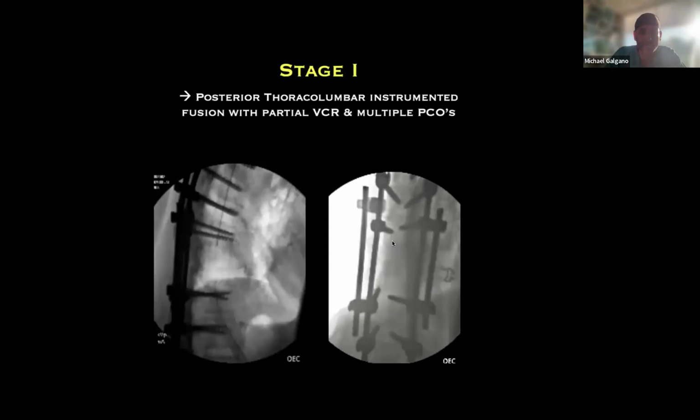So this was a case I did very early on in my career, and we decided to do this all posterior. I think doing these posteriors is really a nice, reliable way. You can get your pedicle screws in, you've got full control of the spine, and you can do your PVCR, your posterior vertebral column resection, right?